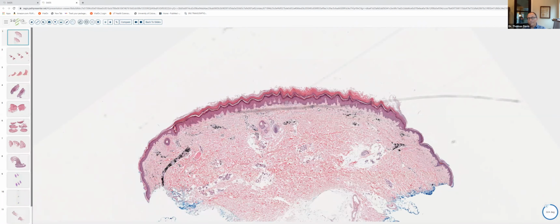When we do see a splinter introduced into the skin like this, it's always a good idea to carefully examine the splinter. And what we look for at times is the presence of dematiaceous or pigmented fungi or colonies of bacteria, because this is a common mode for implantation of those organisms into the skin. In the case of a dematiaceous fungus, this is how I think a lot of phaeohyphomycotic cysts form, or you can set up a deep cellulitis or bacterial infection if there are pathogenic bacteria in the plant material as well.